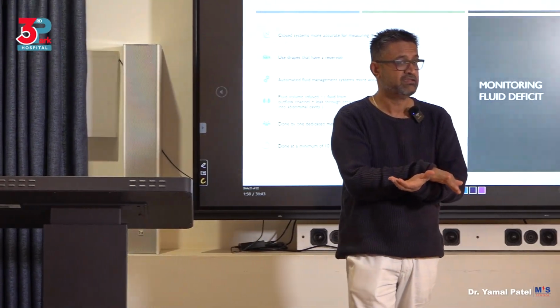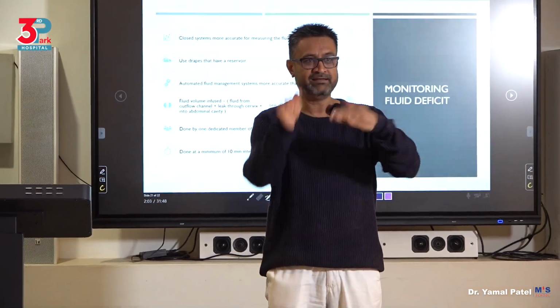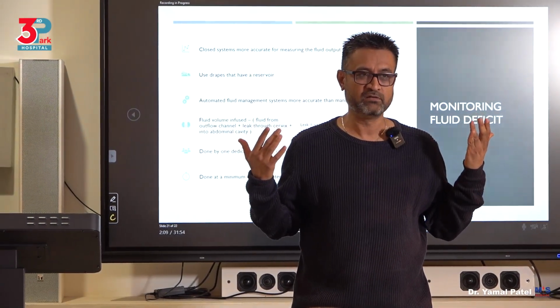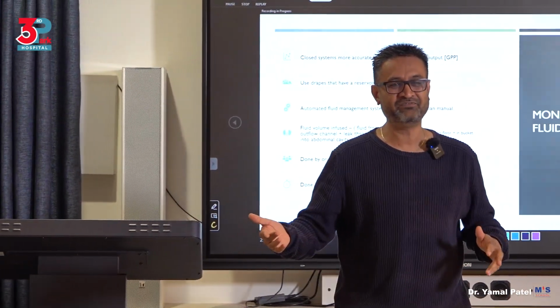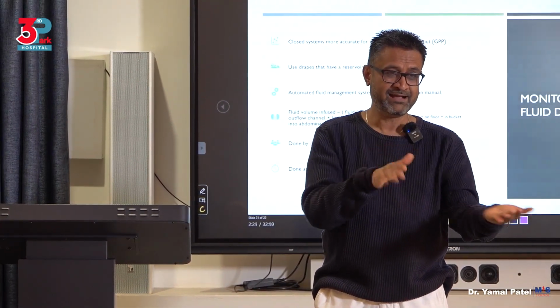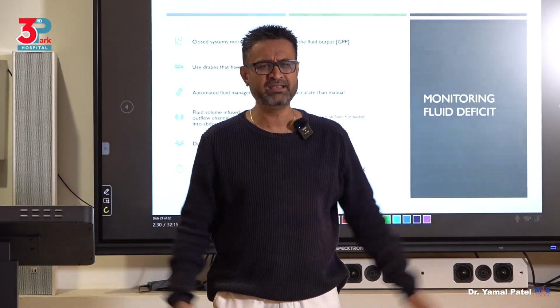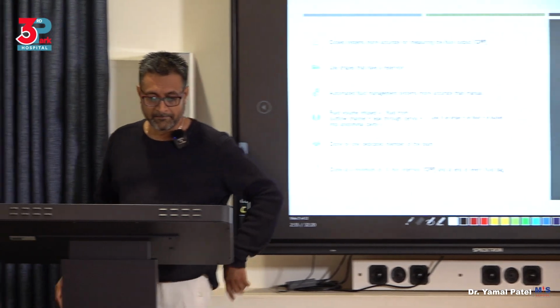Are we understanding, Joy? When I'm going to do something like polypectomy or myomectomy, this underpad turns this way, not this way. I don't want the fluid to be absorbed. That's not what it's meant for, okay? Good, so that I can count. The reason I don't is because I don't take that long. I'm done in 15 minutes. But if I am to do a complex procedure, then if the underpad is that way, I can calculate. If the underpad is white on top with that material that just absorbs fluid, how will I know how much has been absorbed? How will I calculate? Think about it.